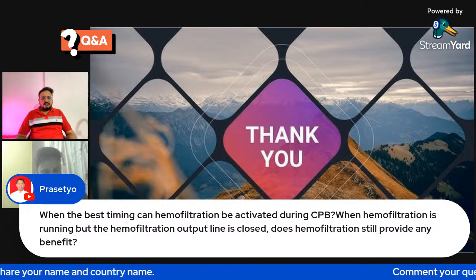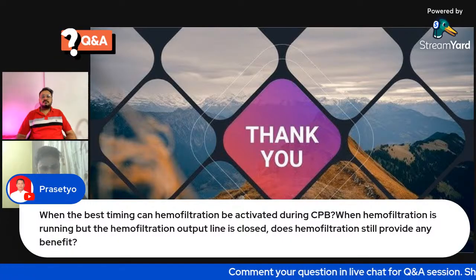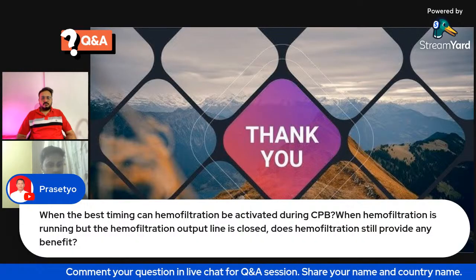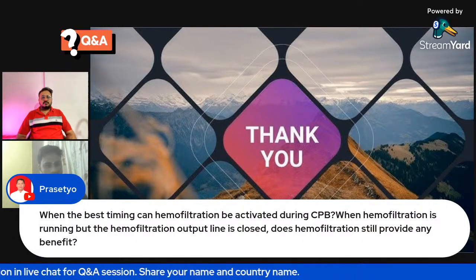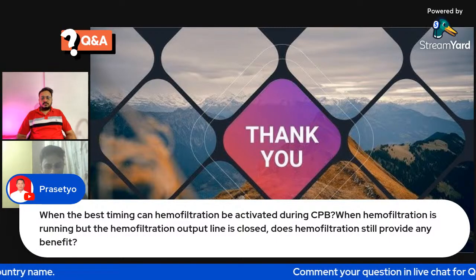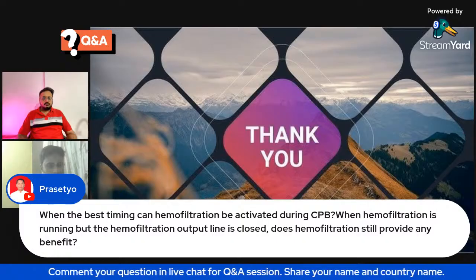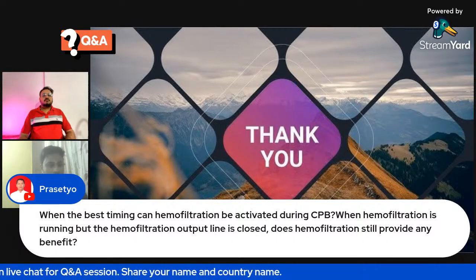When is the best timing to start hemofiltration on CPB? After delivering cardioplegia, one thing: if we are using Del Nido cardioplegia, hemofiltration is very beneficial because a lot of cardioplegia volume will come. If the patient has a large volume, such as a dilated LA or LV, or cases like DVR plus TV repair, then we will start ultrafiltration.